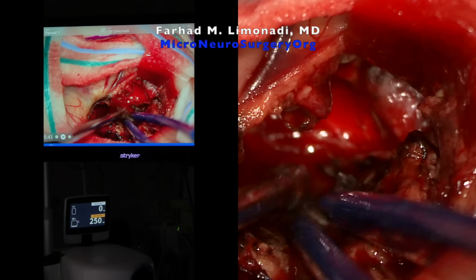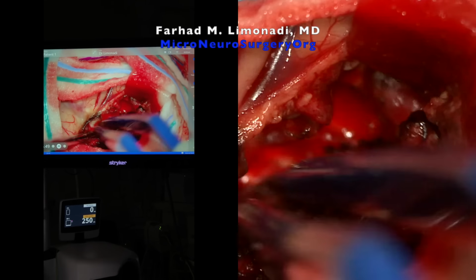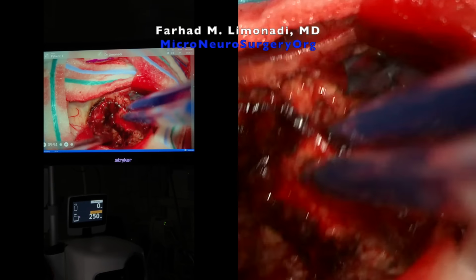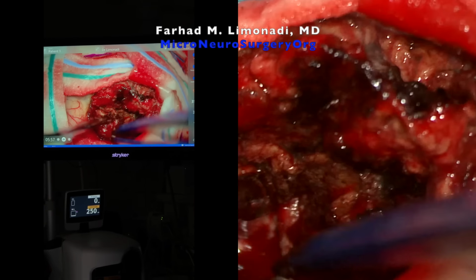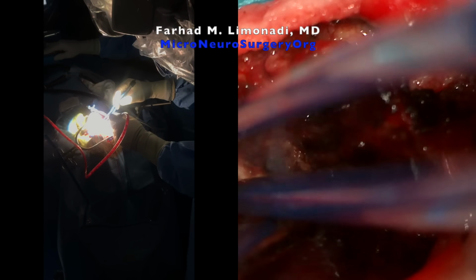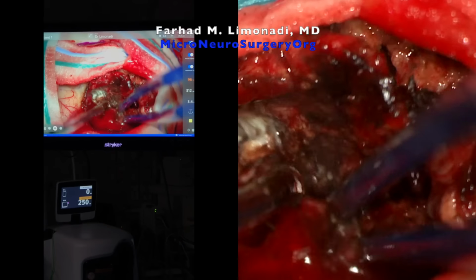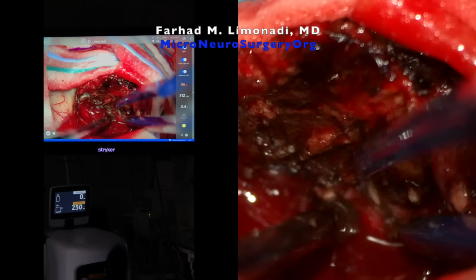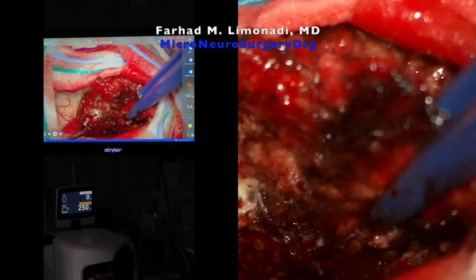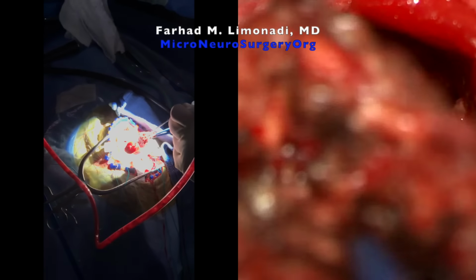Again, staying only on the tumor, not on the brain, very carefully, making sure we don't leave anything around. That's the tumor and an empty cavity.